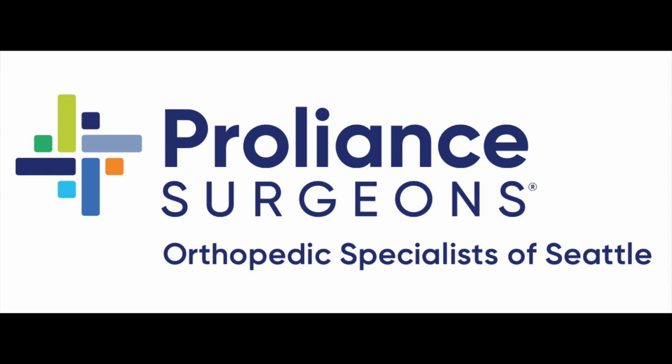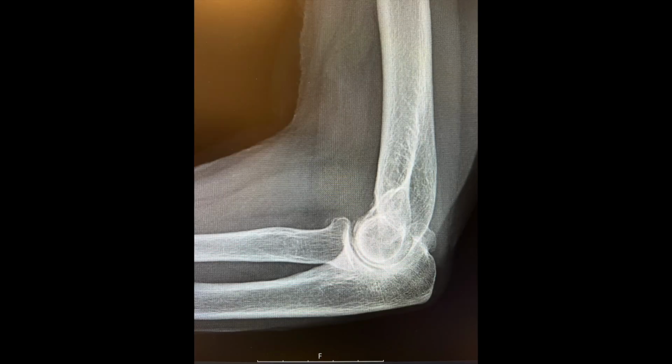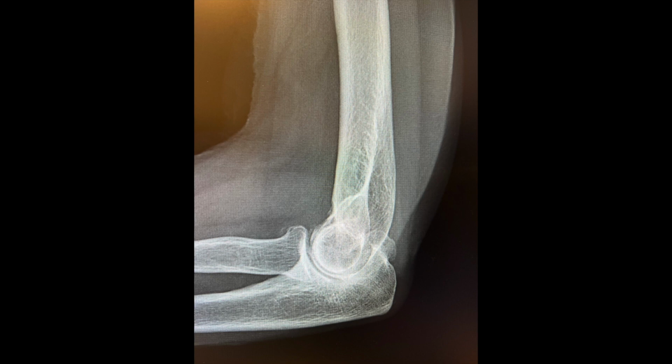Dr. Wayne Weil. I'm presenting total elbow arthroplasty. This is an 86-year-old female with painful right elbow who has failed conservative management, including steroid injections. The x-rays demonstrated advanced stage osteoarthritis of the elbow joint.